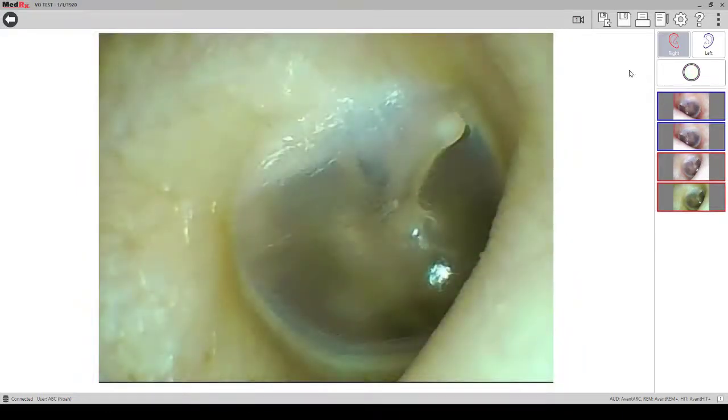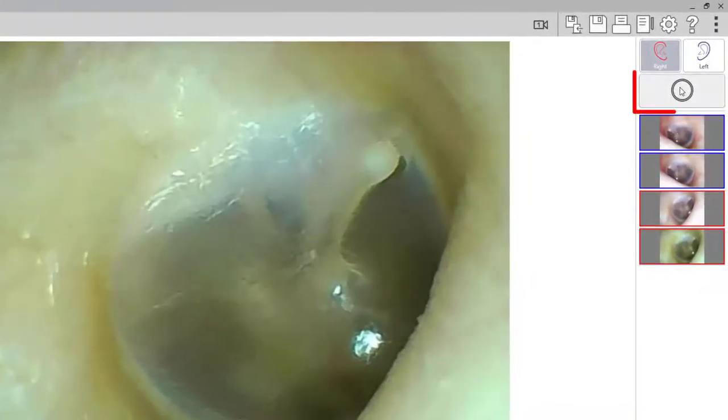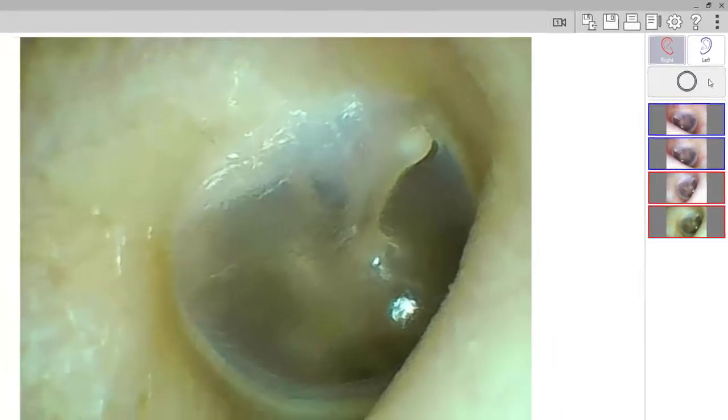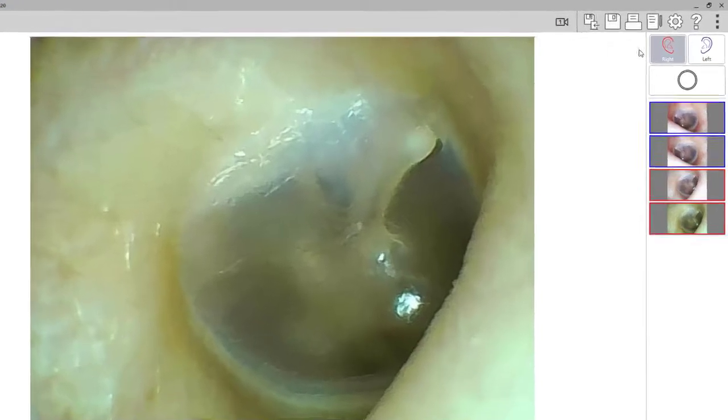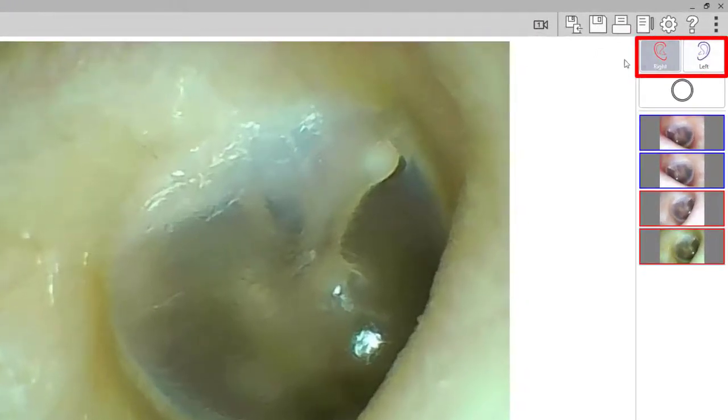While using the video otoscope you can take pictures by clicking on the camera button on the otoscope, by using a foot pedal, or by clicking on the circle at the top of the screen. You can change the ear that you are taking the picture of by clicking the right and the left at the top of the screen, or by clicking on the R and the L on the keyboard.